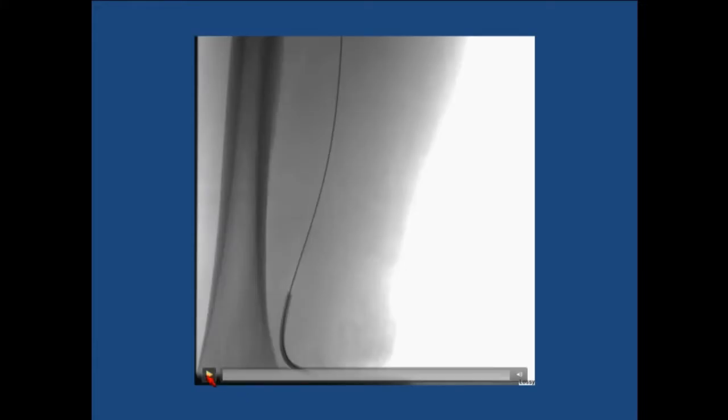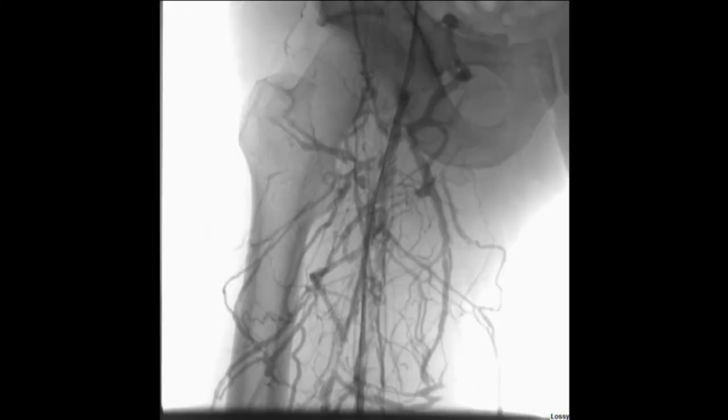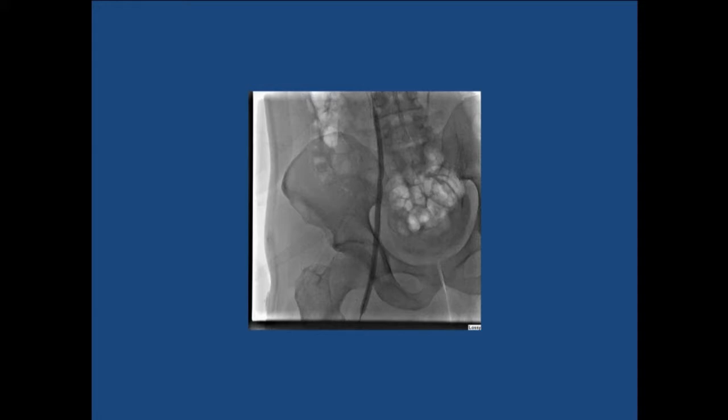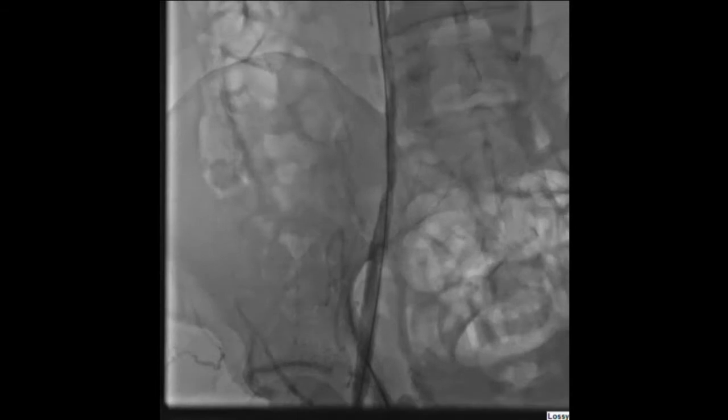So this is first a reverse bolus chase. This is immediately after the ECOS catheter is removed. Contrast injection shows a good amount of improvement, especially in the collaterals. The true lumen is still not completely patent, but there is significant improvement after thrombolysis. This is a still of our ballooning all the way up and down the area of interest. Contrast injection again after ballooning shows final definition of the original true lumen with still some stenosis along the way.